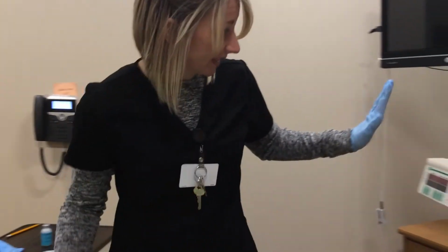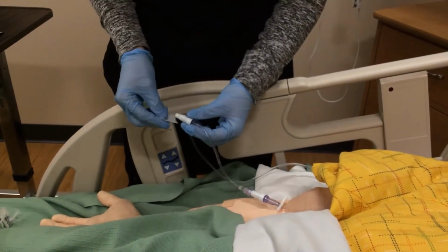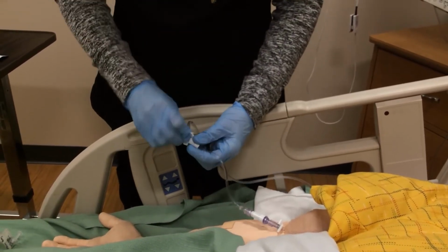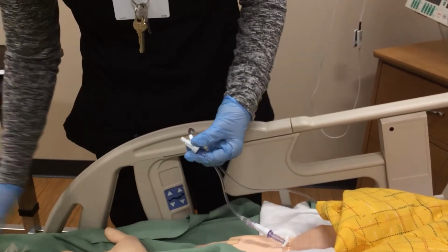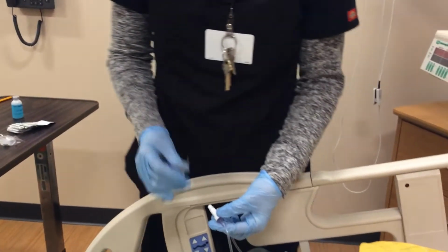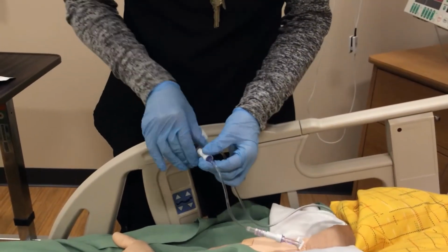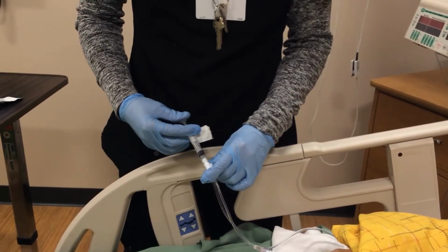So we're saying that this IV fluid is compatible. So what I can do is I'm going to take the port that is closest to my IV site, and I'm going to go ahead and clean it off real good. All right. I've got my morphine. I've done my set of 3 checks. I checked my expiration date on my stuff before I was pulling it from the Pyxis, so I'm good to go. So I looked it up in my drug book in my 15 minutes of prep, and I know I can push it over 2 to 5 minutes.